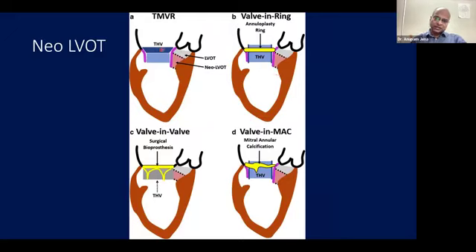With a transcatheter valve replacement, what happens is that the leaflet tissues of the previous valve basically form a tube, and this is the new LVOT that remains. Guidelines recommend that if this new LVOT is less than 200, less than 150, less than 170, then more or less we rule out those cases. Good cases are more than 200. So that is the problem with valve in MAC, because again, the orientation of the valve, the final placement, final angulation of the valve cannot be controlled very precisely.